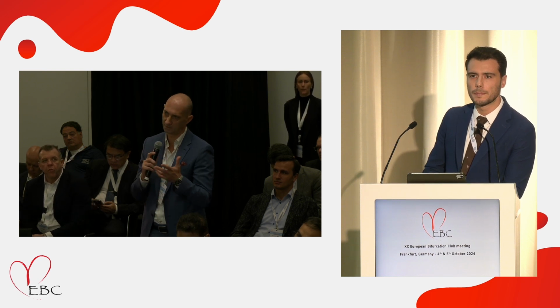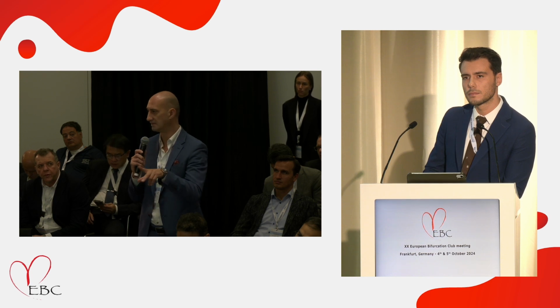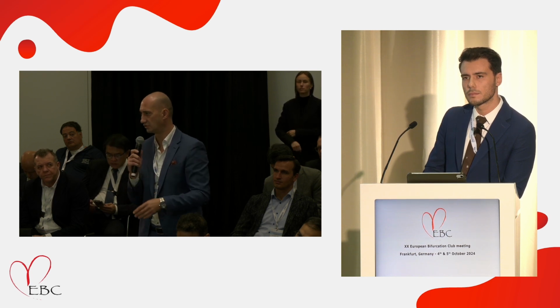Yeah, we had this case that we did a few days ago. We did a kissing stenting, bifurcation and stenting with a semi-compliant balloon. And after the OCT, there was no good stent alignment on the side branch. So after using these two NC balloons of the side branch and the main branch, the stent alignment was good on the side.